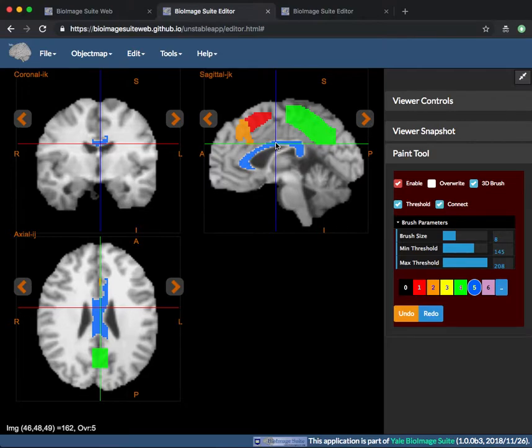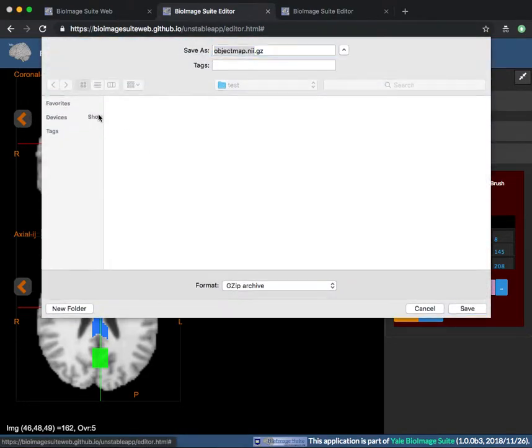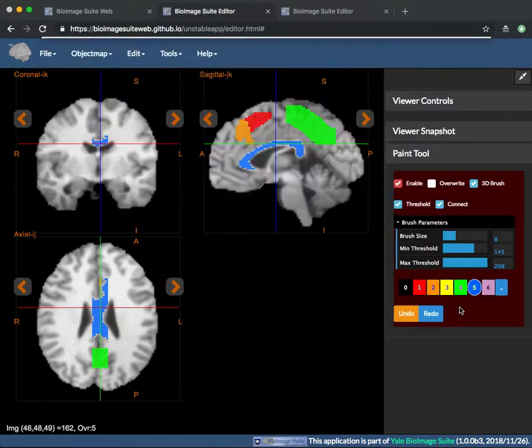In order to save your edited object map, go to object map, save object map, and save the file.